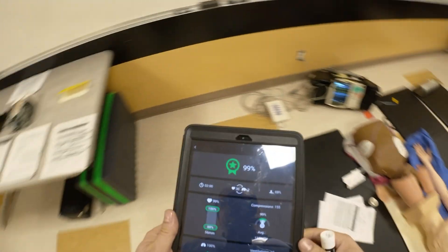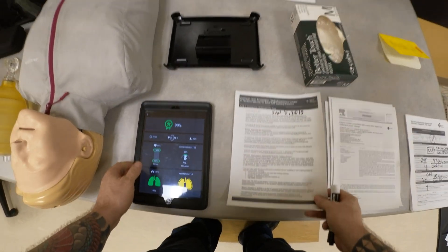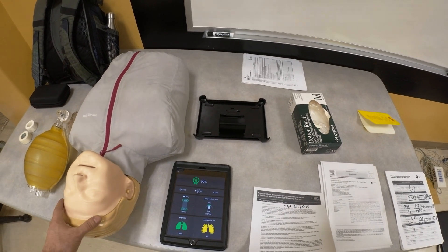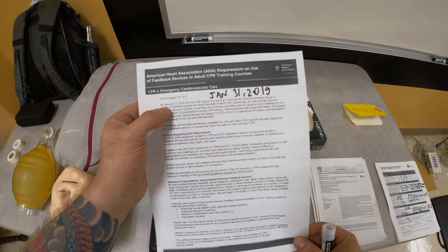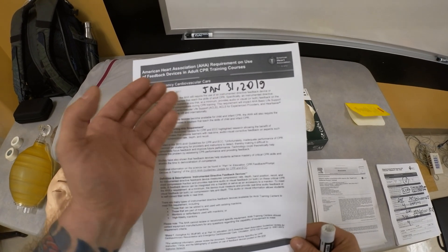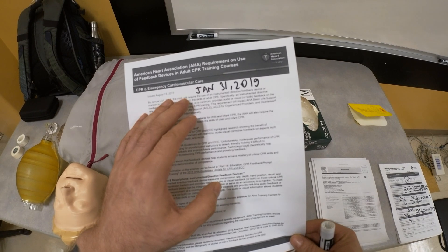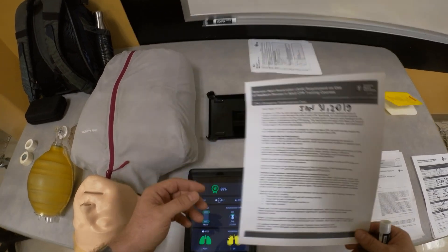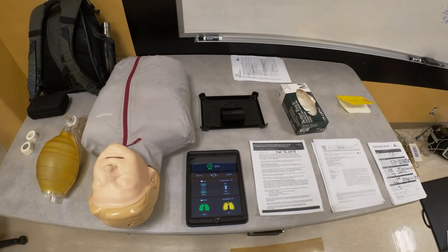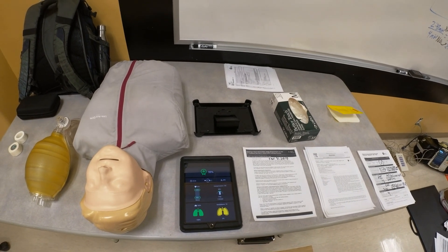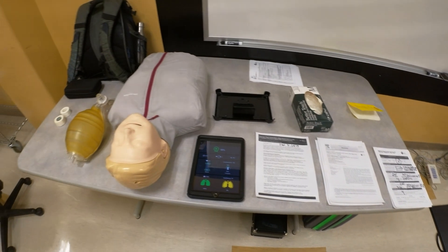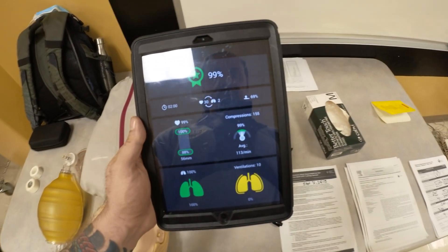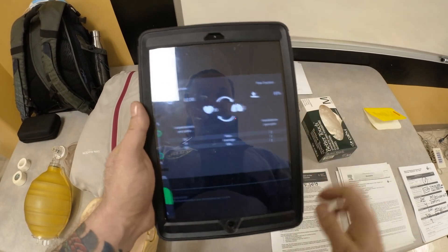Keep that in mind. And the very important thing I want to say is that these feedback devices are mandatory for both BLS and ACLS high-quality CPR. This actually went into effect January 31, 2019. The AHA has implemented this, stating that it's a requirement to employ a direct feedback device via a mannequin. The reason why this is important is that you cannot objectively evaluate the student with all these parameters if you just visually look at the mannequin — you must have an app like this. Once you have your data, you can click on specific points to see the breakdowns.